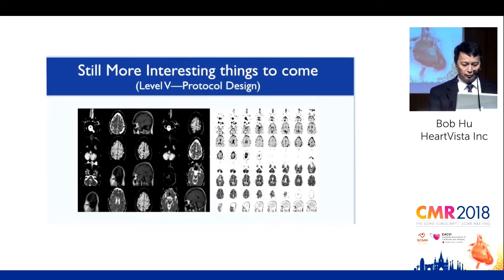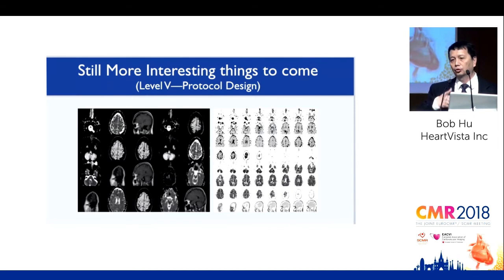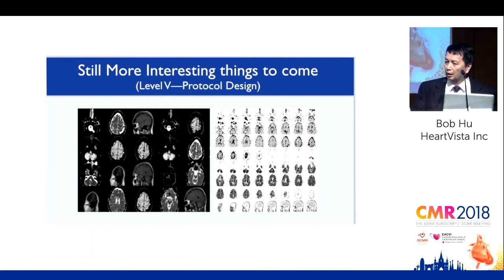useful, once you're able to acquire a set of data like this, is that there's still more to come. What we've shown you is 15 minutes to do the entire ischemic cardiac examination plus 4D flow and reconstructing in that time frame, all done locally with the possibility of having remote supervision. But this is probably still not the optimal way of doing things.